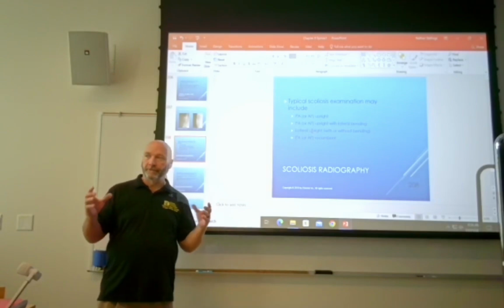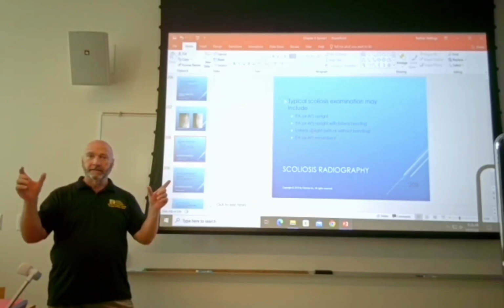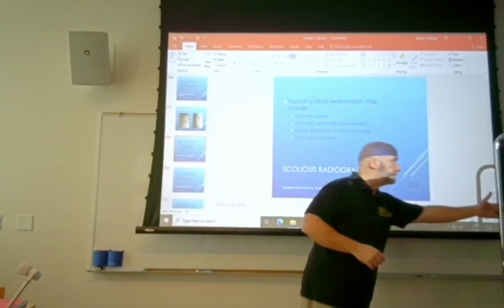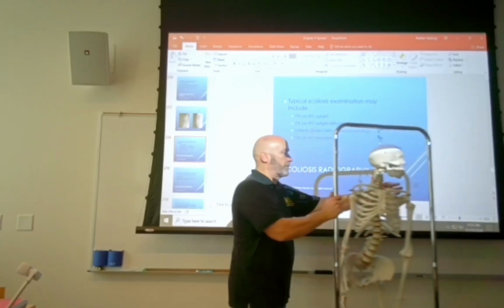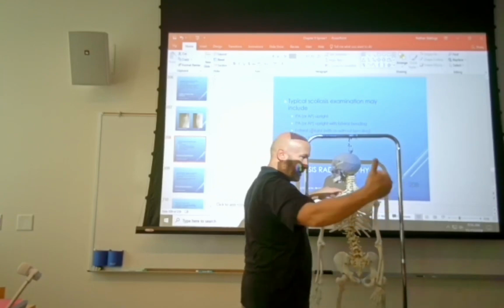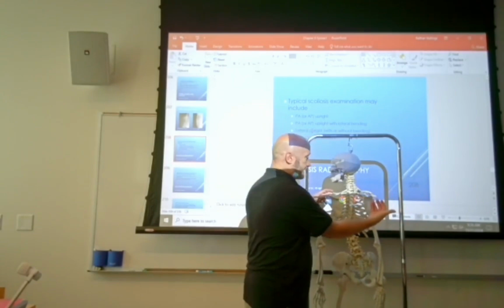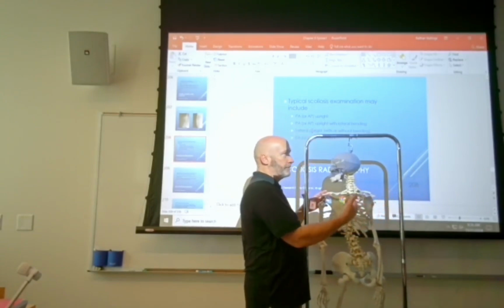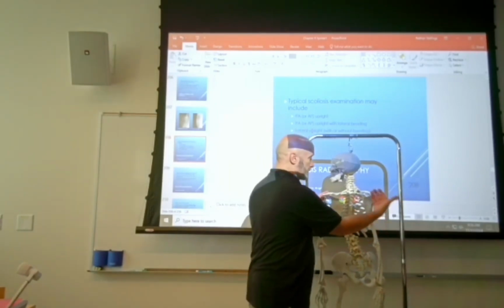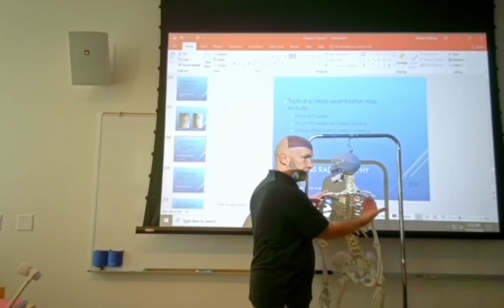A trough filter is kind of like a wedge, and it's a wedge on two sides. If this was our patient, the fattest part of the wedge would be out here laterally. This goes on the collimator housing, but it would be out here laterally, and it would act as a different layer of collimation along with some filtration. So it'd be real fat out here on the edge, and then it would get less fat as it comes in.